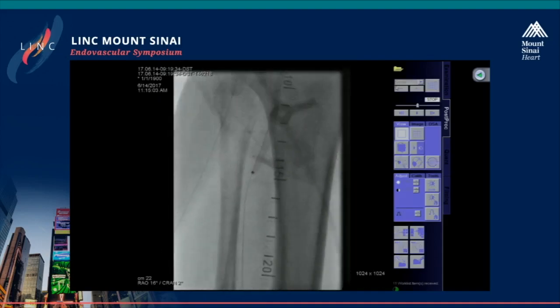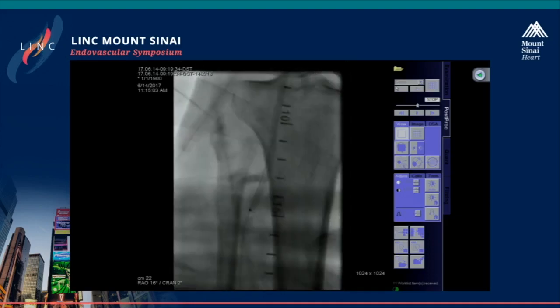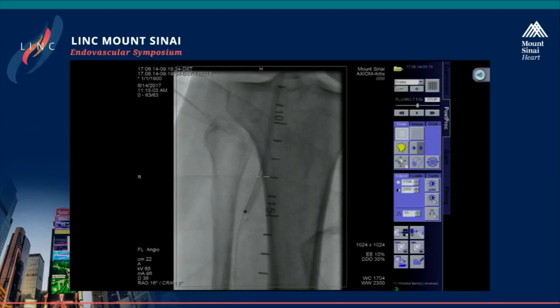Each one of these 3 I've followed with duplex ultrasound. One of them is now out to about 5 years. At the end of the procedure, or this first post-operative duplex at a distal SFA, there was about 1.3 centimeters, or maybe 1.2, around that. It's just stayed completely stable for 5 years. So I think it's a concern to follow if you see them, but I've had very few of them. Is that a focal, saccular-looking type of ectasia? Yeah, just a little ectasia.